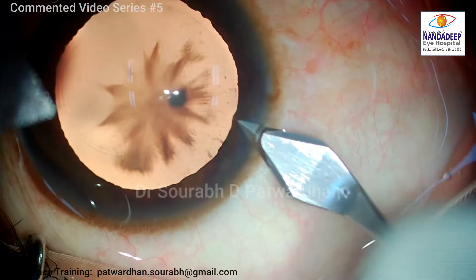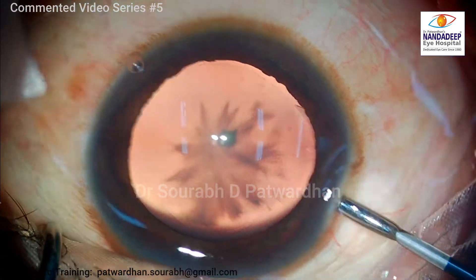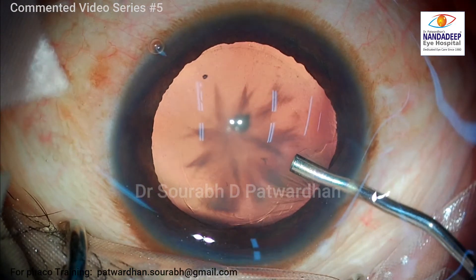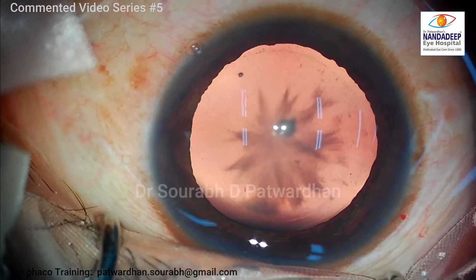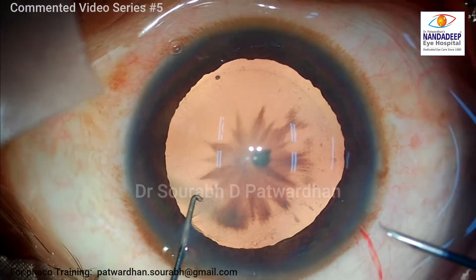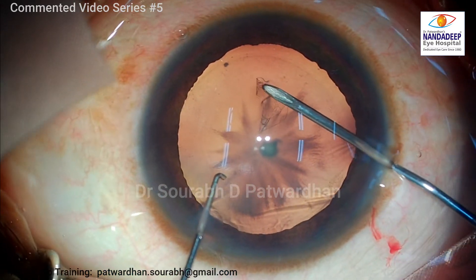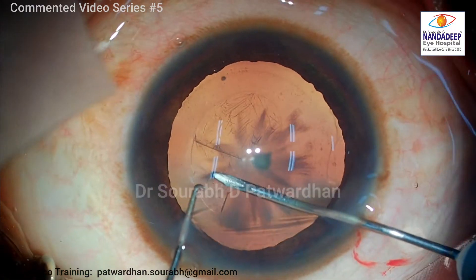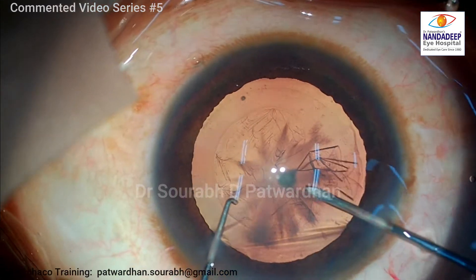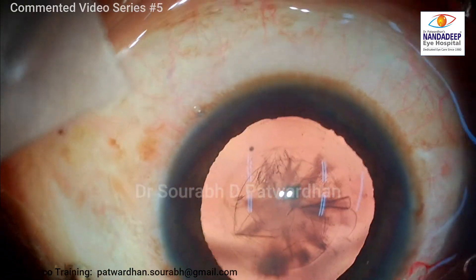You can see that there are some sphincter tears already there. I have checked this patient thoroughly preoperatively. You have to check the patient in undilated status and note down the pupil size, because post-trauma there can be traumatic mydriasis. If the pupil size in the undilated state is large, the patient may face some glare in the postoperative period, so in such cases we may have to do pupiloplasty. In this patient the undilated pupil size was 3 mm, so I decided not to do any pupiloplasty. Still, before I close the surgery I will put some diluted pilocarpine and check the final pupil size.